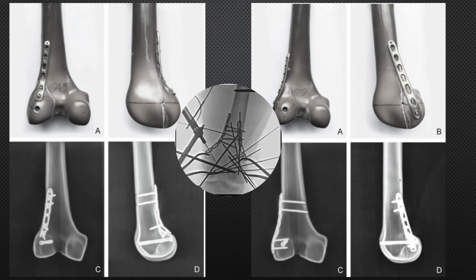And there are some concerns about how to place the plate so far posterior, because you have the insertion of gastrocnemius here, and also you have the risk to neurovascular structures which lie close to the notch part. So some safety concerns are definitely there. So biomechanically you need not place the plate directly posterior. You can place the plate directly over the ridge. Like I've shown you in this image, these plates are not placed on the posterior surface. They are placed on the posteromedial and posterolateral ridges.